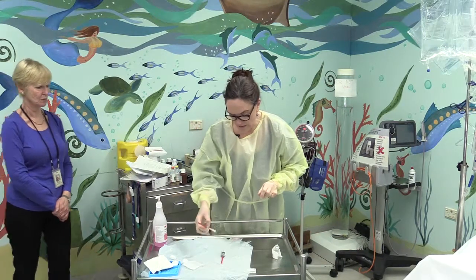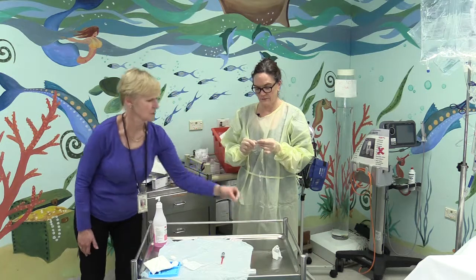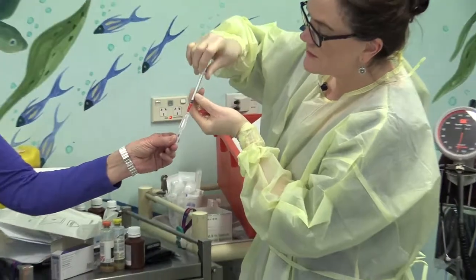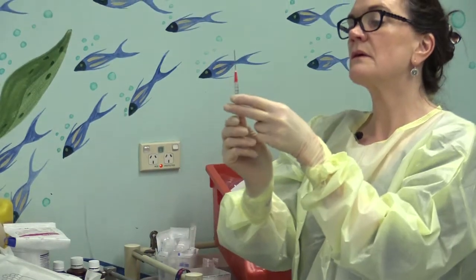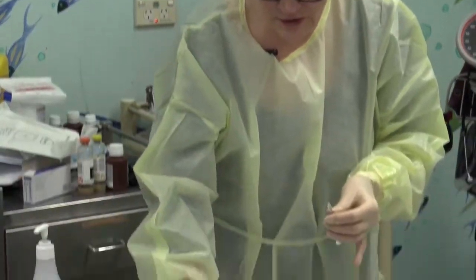And I'm going to now draw up my gentamicin, at a dose of 0.6 milligrams per kilogram. And then for each syringe, I'll change to a sharp needle.